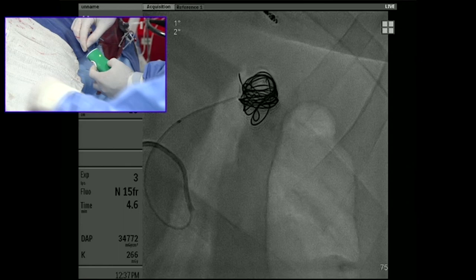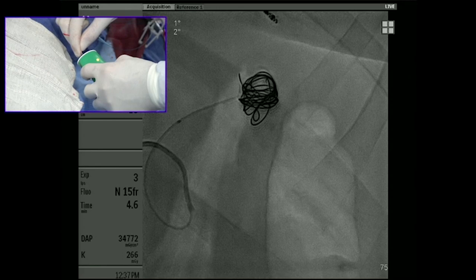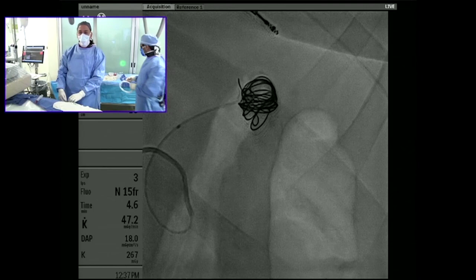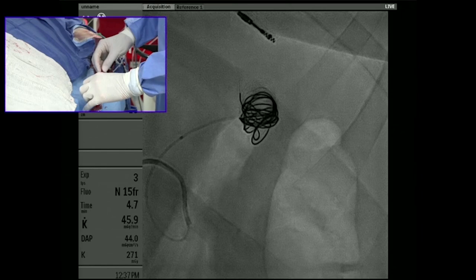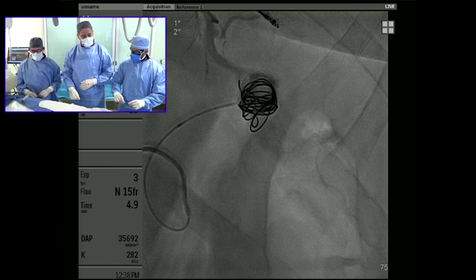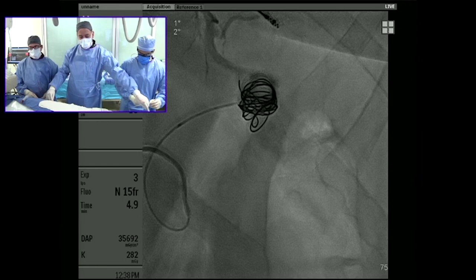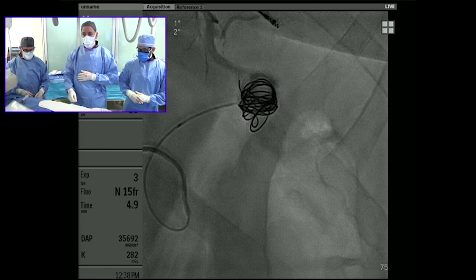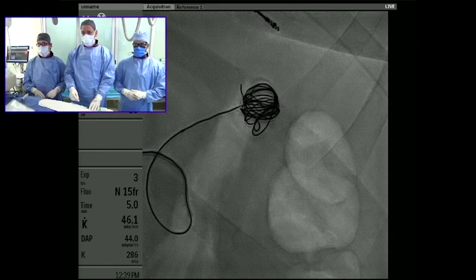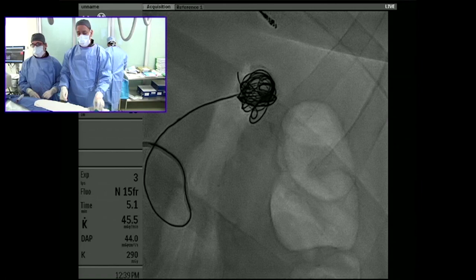The next coil is an Azur CX coil — a coated coil with a gel substance on the outside that promotes thrombosis. This is very helpful in patients on anticoagulation because it doesn't rely on the clotting cascade to thrombose the vessel. We push this through the microcatheter into the sac, filling in the gaps created by the framing coil scaffold.